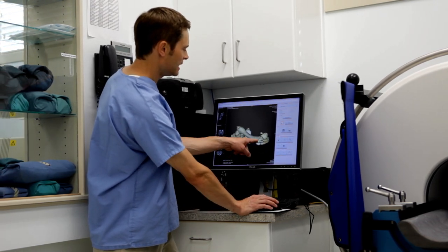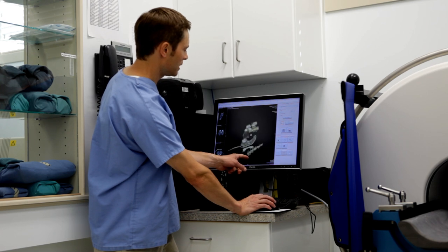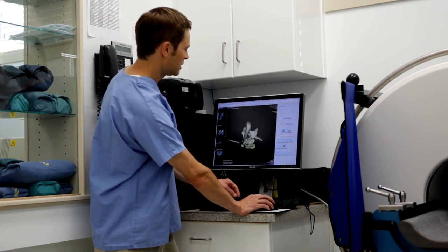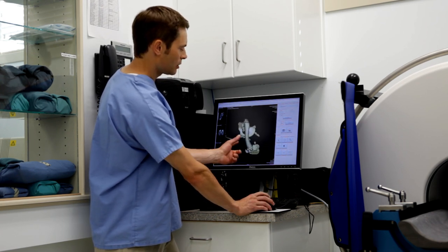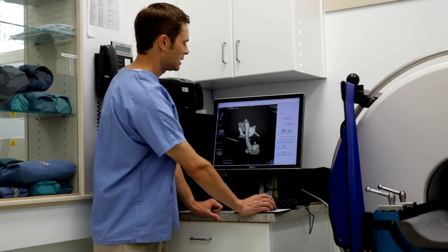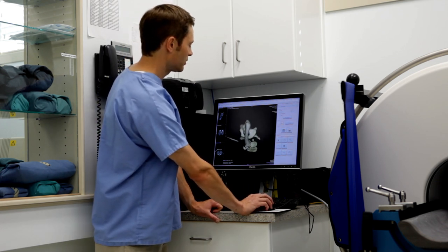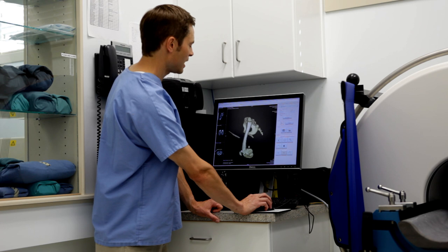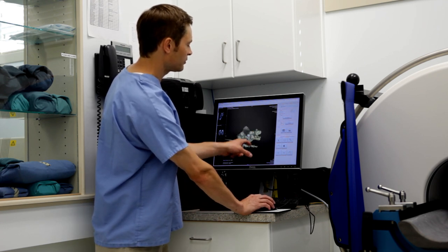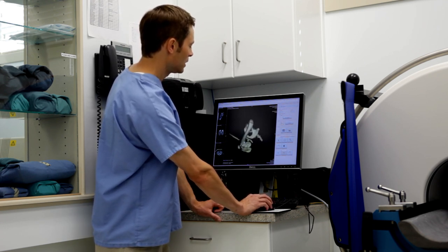This is a knee that was fractured in a hit-by-car situation, and this is what we call a distal femoral comminuted fracture. In this case, there were five different pieces of bone that we had to make a surgical repair plan for.